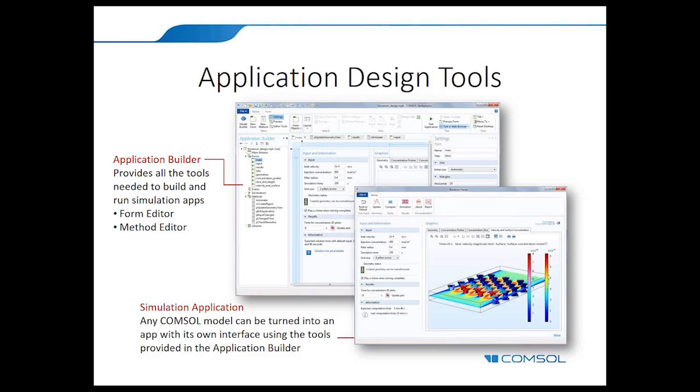Now let's return to the COMSOL Desktop once again, focusing on the application builder instead of the model builder described previously. The application builder allows you to create simulation applications from your COMSOL Multiphysics models. Within just a few clicks, actually, you can have a basic app that's ready to share with your colleagues or customers. They do not need to know how to use COMSOL in order to use the app that you designed for them, but they can still benefit from its modeling capabilities for product design.